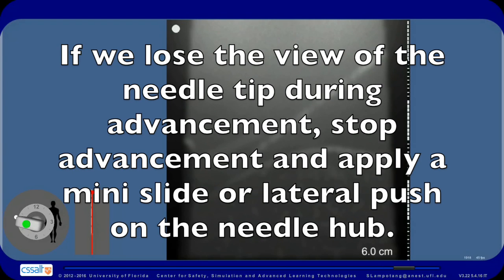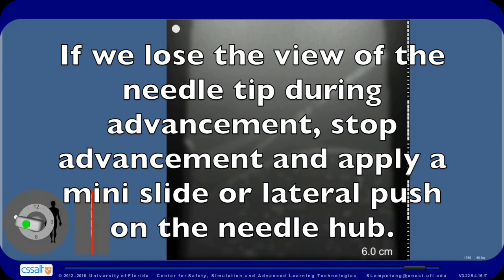If we lose the view of the needle tip during advancement, stop advancement and apply a mini slide or lateral push on the needle hub.